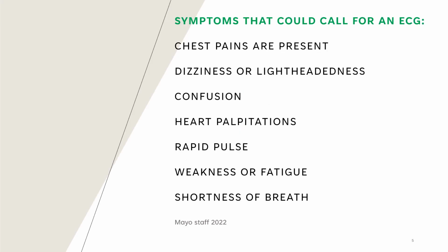So, symptoms that could call for an ECG. Your physician may recommend an ECG if you present any or a combination of the following symptoms: chest pains, dizziness or lightheadedness, confusion, heart palpitations, rapid pulse, weakness or fatigue, or shortness of breath. Any combination of those, your physician may call for an ECG just to make sure that everything is functioning the way it should be.